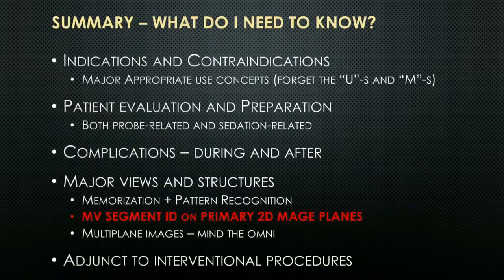One last question, just in the interest of time. Infection control at our institution is recommending that you use a sheath for TEE to lower the risk of HPV transmission. This is not an issue we've faced. I imagine something like this might come up at your institution? Maybe. It hasn't yet.